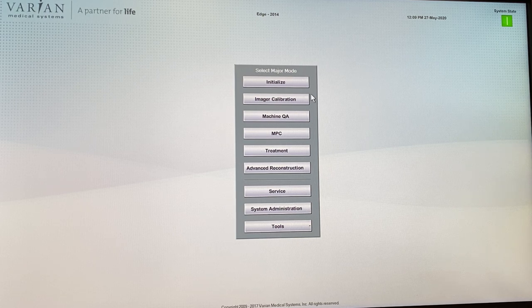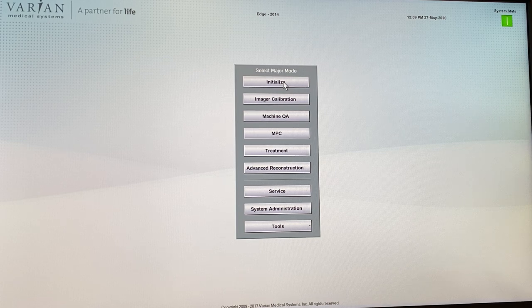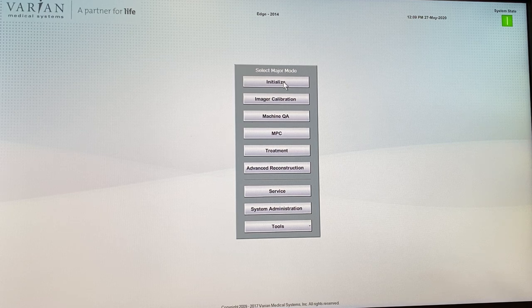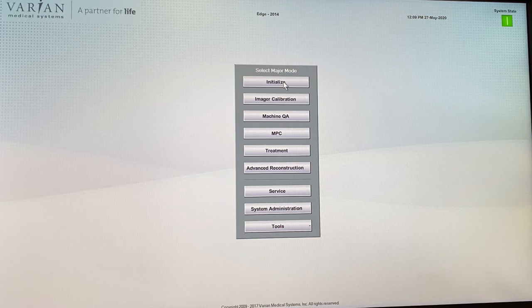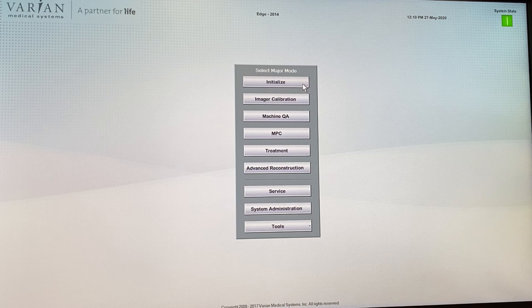Let's start with Initialize. Initialize allows us to initialize the machine. When the machine has been powered off completely and has no power at all, it loses memory of certain mechanical limits and positions. For example, the KV arm, the KV detector panel, and the MV detector panel move around, and initialize makes them go from one limit of their motion to another so the machine can learn the limits of motion and know exactly where parts are.